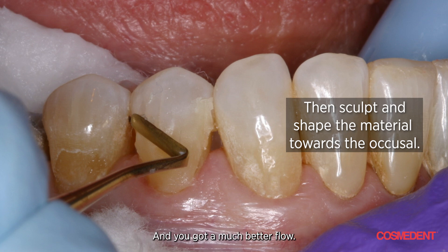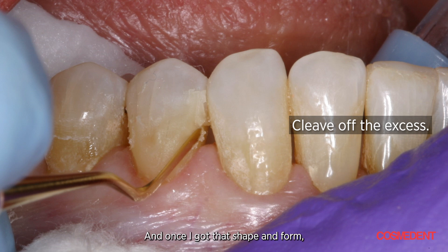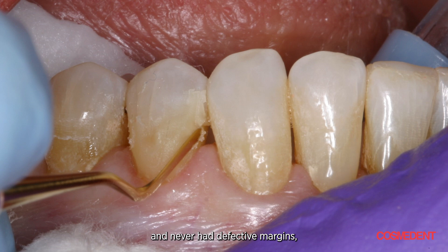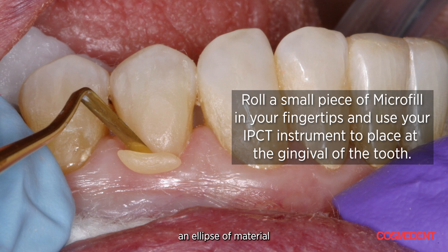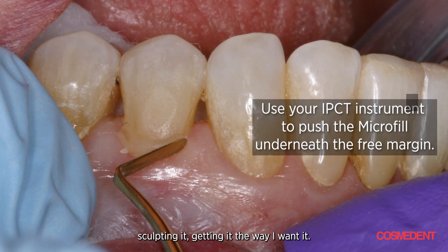You get a much better flow. You can see I cleave off the excess. Once I've got that shape and form, I polymerize it. One of the criticisms of microfill is more shrinkage than other materials — but I never had shrinkage or defective margins, and that was through serendipity. As a technician, I knew I couldn't seal the margin with a single application, so I did the best I could, polymerized it, got the shape, then added an ellipse of material down there to close all the margins, shaping and sculpting it the way I wanted.